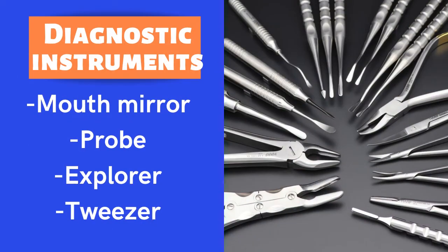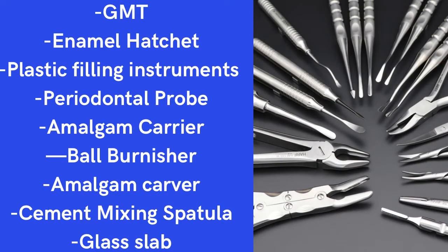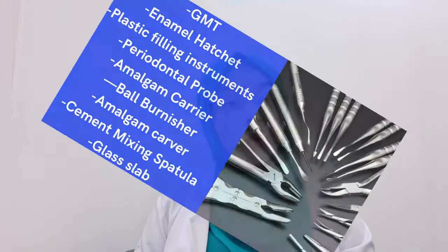For hand instruments, you will need a diagnostic set — which includes a mouth mirror, probe, explorer, and tweezer. Other instruments include: GMT, enamel hatchet, plastic filling instrument, periodontal probe, amalgam carrier, amalgam burnisher, amalgam carver, and cement mixing spatula.